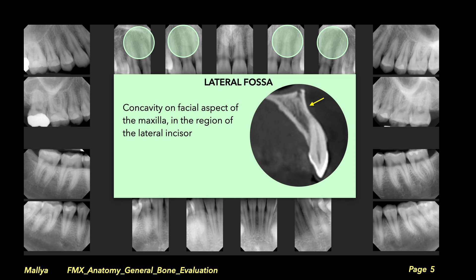The first anatomic radiolucency is the lateral fossa, located in the maxilla in the region of the maxillary lateral incisor. As you will note from the CT scan, there is a depression or concavity on the buccal surface, resulting in a decreased thickness of bone, making the bone around the lateral incisor look relatively more radiolucent. The radiolucency is diffuse in nature and you can still appreciate a trabecular pattern through the radiolucent area.